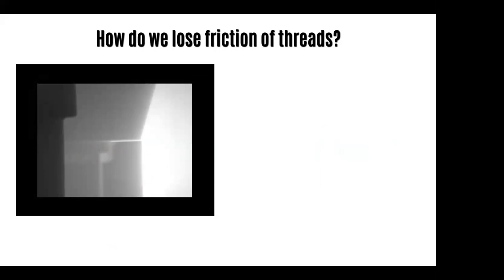So what happens to the screw when the joint opens up like this? It gets even more stretched out, right? When the joint opens up, the screw gets stretched out even more, so it's in bigger tension. So what about the friction between threads at that point?